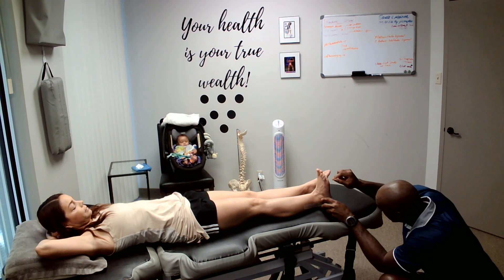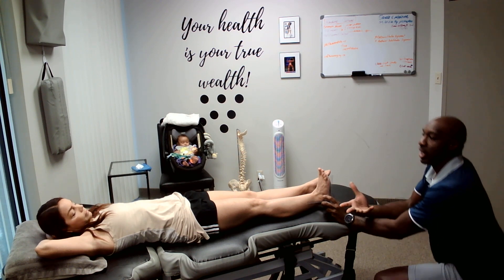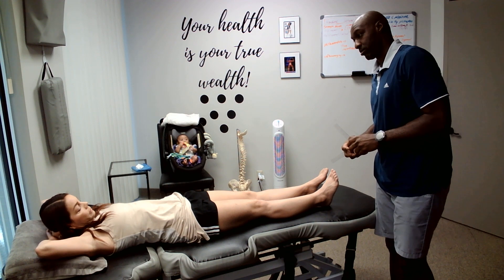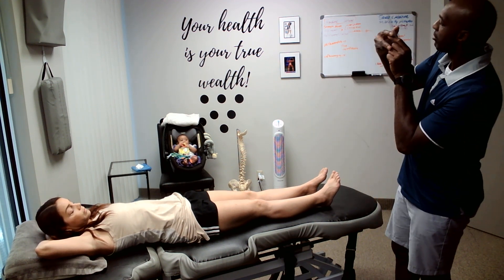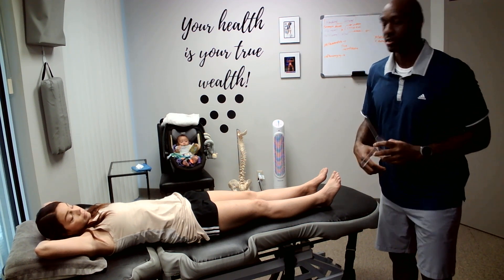Is that as far as you feel like you can go? 10, 11, 12. So optimal range is about 20 degrees. You're at 12 degrees of dorsiflexion. You're at 10, 11, 12 — 12 degrees of dorsiflexion.